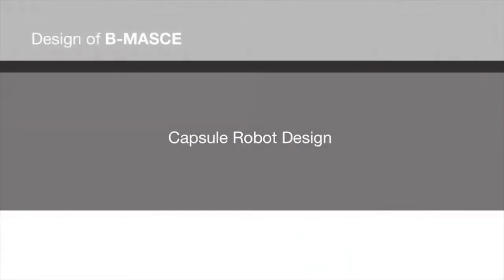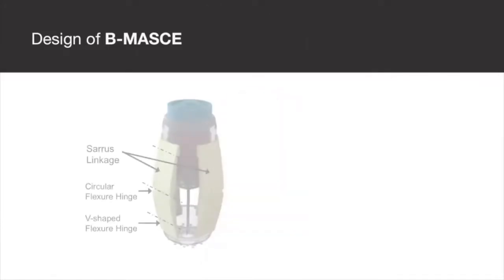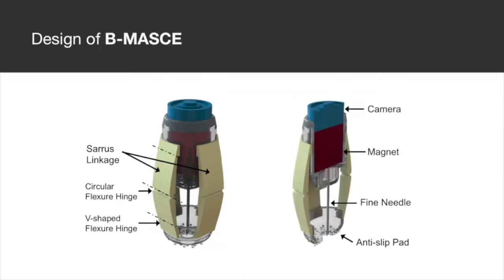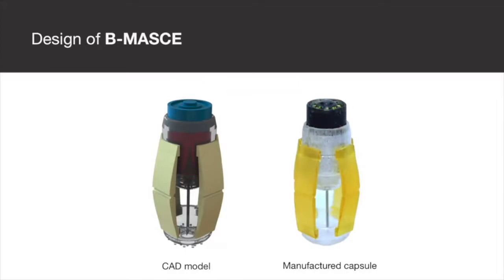We have designed a capsule robot with the fine needle aspiration biopsy functionality. It is composed of a magnet, a fine needle, two pairs of elastic Sarrus linkages, a camera module, and an anti-slip pad.